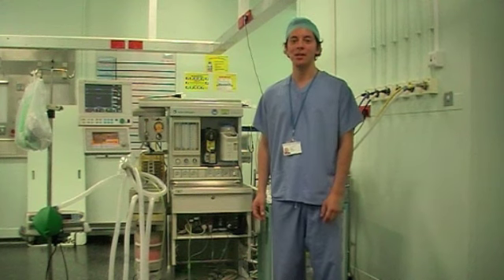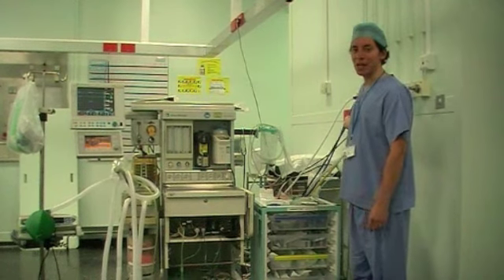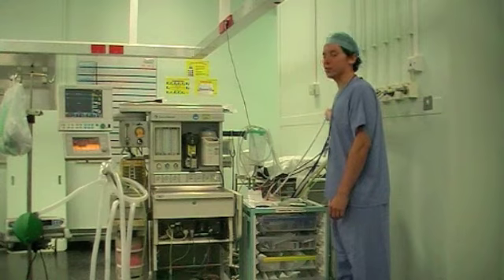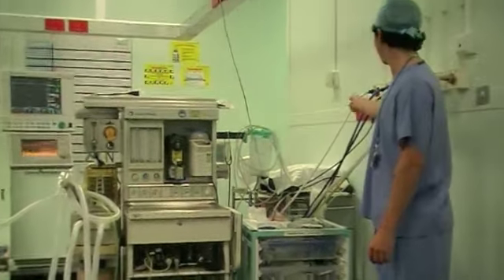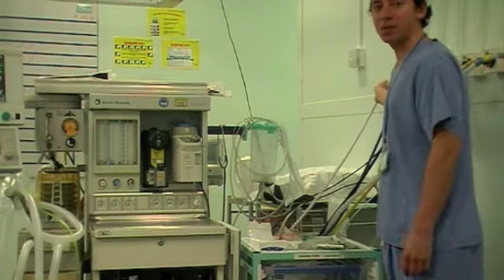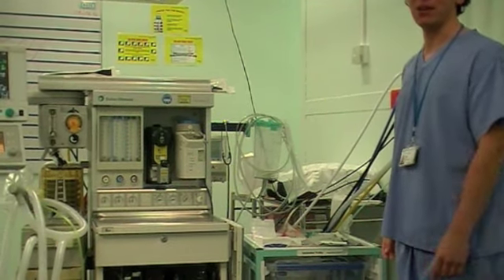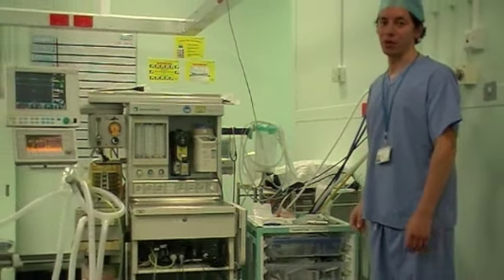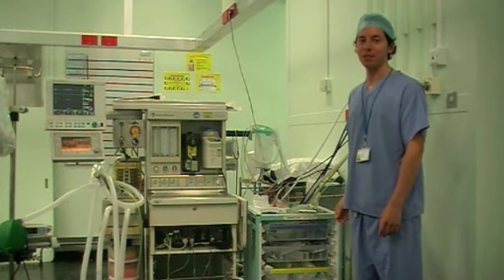First, check the main pipeline supply. We have the medical air which is a black pipeline, nitrous oxide which is French blue, and oxygen which is a white pipeline. You want to perform a tug test on each of the pipes to ensure the correct pipe is fitted into the right outlet. The tug test will show that if the wrong pipeline is in the wrong socket, the pipe will come out quite easily.